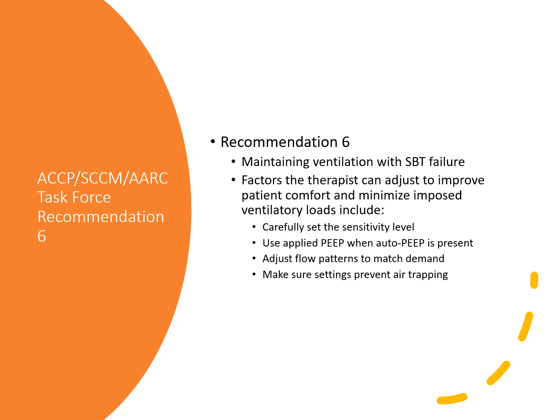So when it fails, we should get a stable, non-fatiguing, comfortable form of ventilatory support to that patient. In other words, put them back on that mode where the patient doesn't do the work, right? That the patient gets the most support. So that would be your CMV type mode for at least 24 hours or so to allow those muscles to unload, to optimize the patient comfort and sedation needs, and prevent any complications. That will help the patient recover and see if that'll help them get ready.